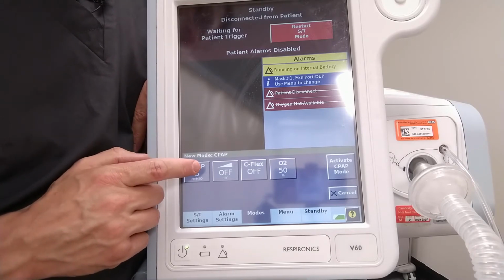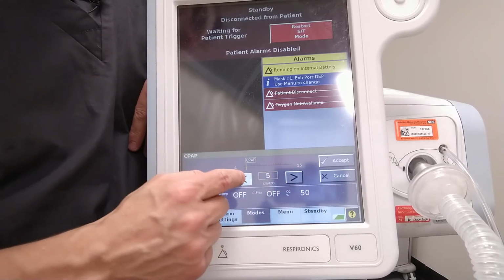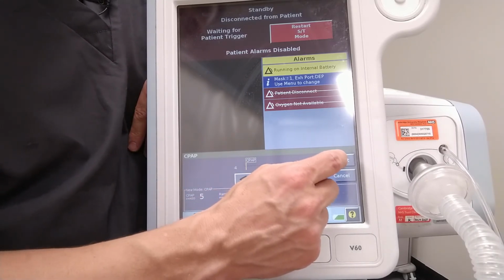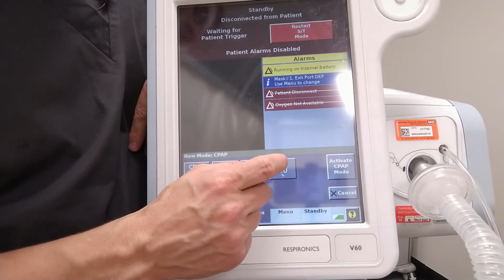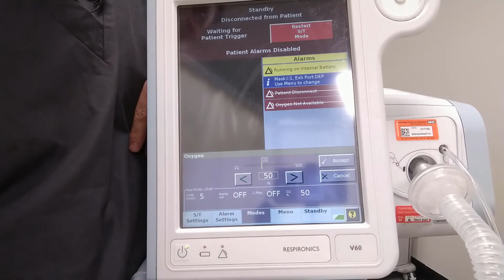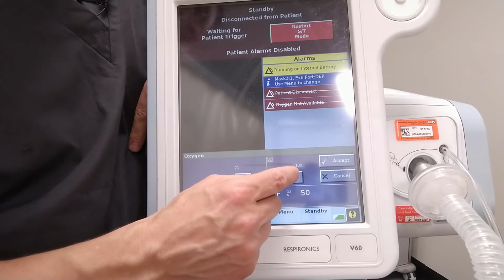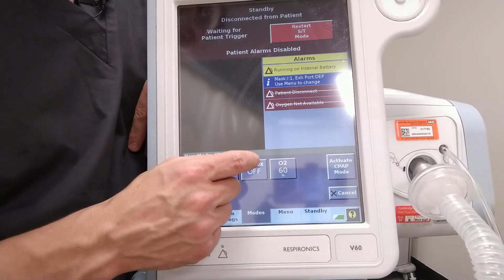To enter the pressure that you want, press CPAP and use these arrows to select the pressure you want to deliver. Typically, we start it at 5 centimeters of water, and then press Accept. To select the FiO2 that you want to deliver, press O2, and then use the same arrows to select the FiO2, and press Accept. And then C-Flex.